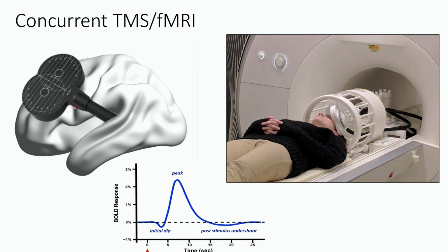So just doing the mapping, you say, oh, that's cool that other people are doing theta burst in the scanner. They're doing 10 hertz and capturing the evoked response, and that's more similar to what we do clinically, so isn't that better? I would say they're just different, right? Doing repetitive TMS with the aim of neuromodulation is different than a basic just ping the circuit, map it, right? Which is what we do with single pulses.